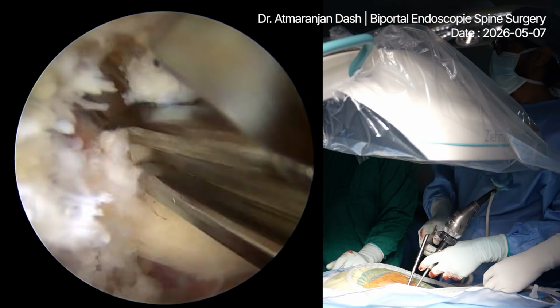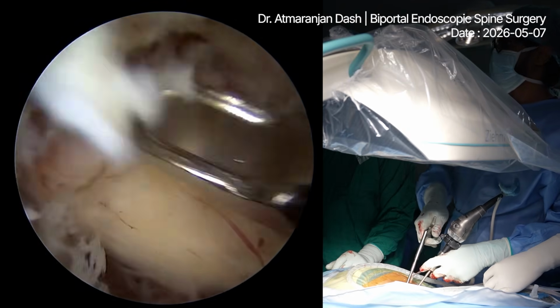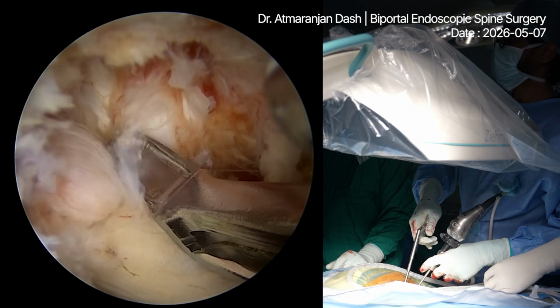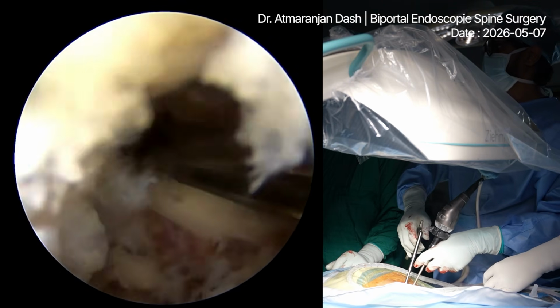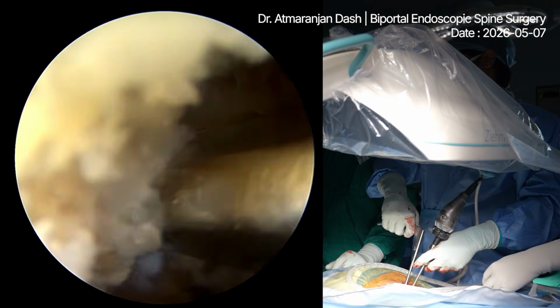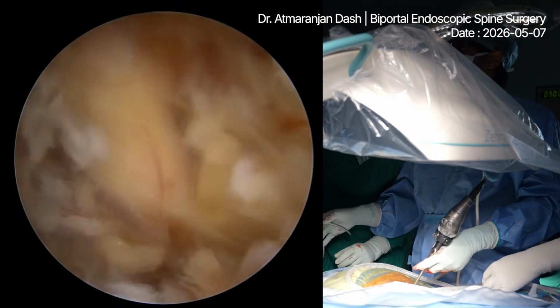So we are going deeper inside the canal. Otherwise, getting results will be difficult. So this is a disc you see. Drill though. Give me a drill.